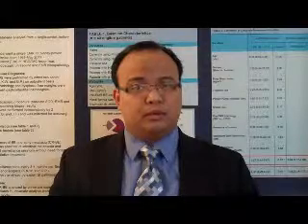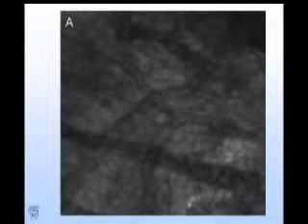This increased uptake is facilitated by GLUT1 transport mechanism. Based on these findings, we have proposed that 2-NBDG can function as an optical bioprobe similar to FDG in PET scan. Normal mucosa would show absence of intracellular fluorescence. In contrast, dysplastic mucosa would have intense intracellular fluorescence together with disorganized cellular architecture in keeping with the histopathological characteristics of dysplasia.